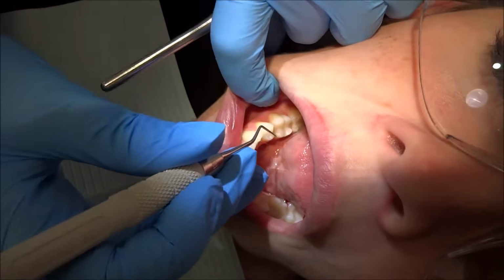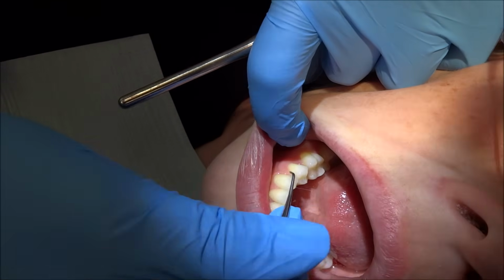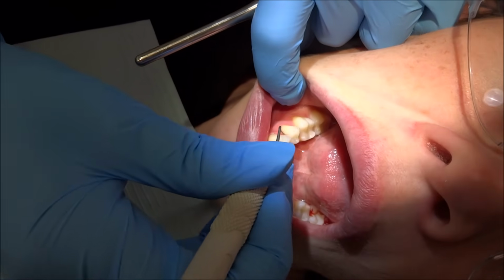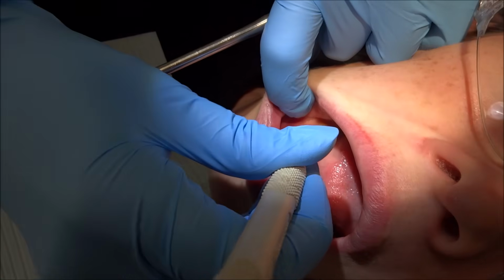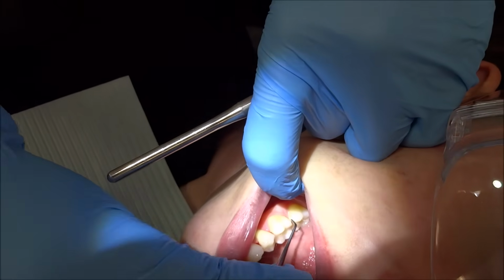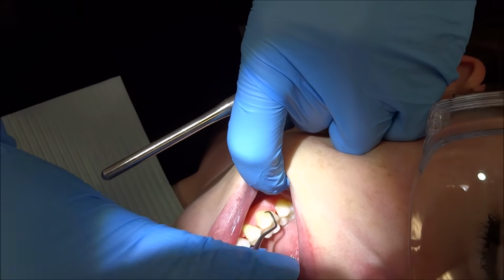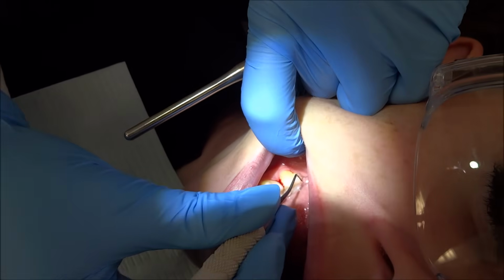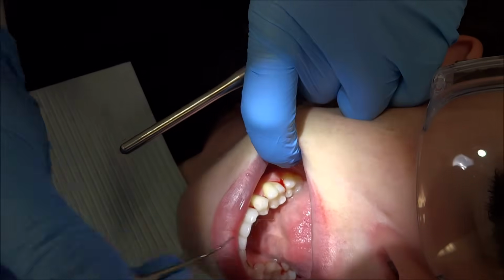Then over to the buccal here. Sometimes I like to count my canines in with the distal of my canines in with my posterior teeth. Now I'm going to switch my instrument and do my anteriors.